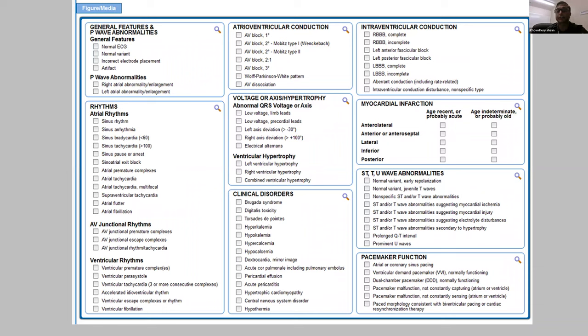And as Rafique Bhai pointed out, the board really wants you to understand the atrial mechanism, ventricular mechanism, and atrioventricular relationship, and then the morphology of the STs, and what you can deduce from that. And uniquely, there is a column for pacemaker, which Rafique Bhai has addressed many times, that is how you diagnose pacemaker function. That is another category.